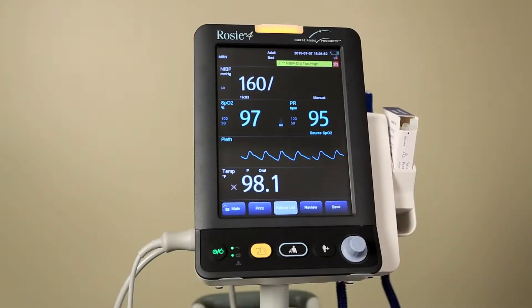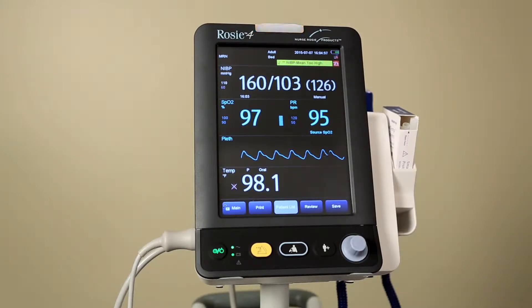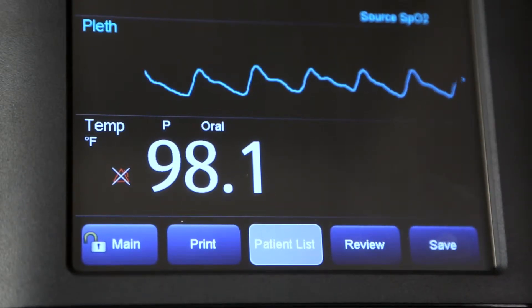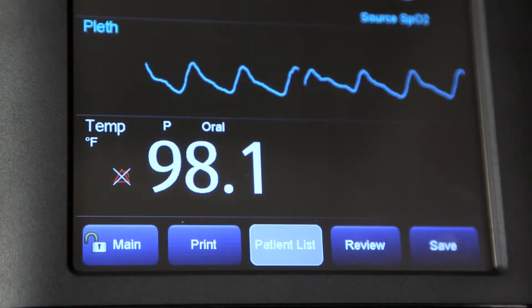The Rosie 4 comes with an alarm light and SmartTemp module. On the touch screen you will find the battery, connection, and sub-icons, patient information, blood pressure, SPO2 pulse rate, temperature, and soft keys. Below the soft keys you will find the hard keys and a gray knob. The soft keys are graphic keys on the screen, giving you fast access to certain menus or functions.